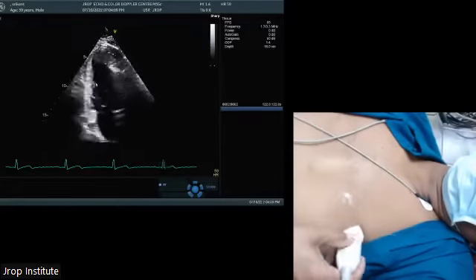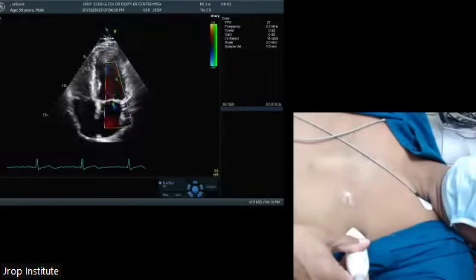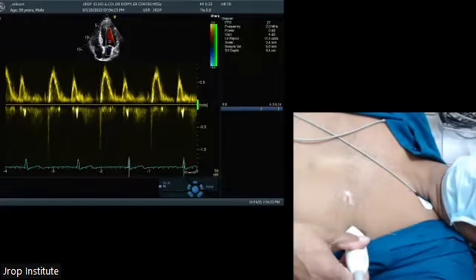And in this window, what do we do? We'll measure the mitral flow patterns. Here is the place where we'll do the mitral flow patterns. So this is the E wave, this is the A wave. Whenever stenosis is there, we'll trace out the whole Doppler spectrum pattern and then get the pressure half time.